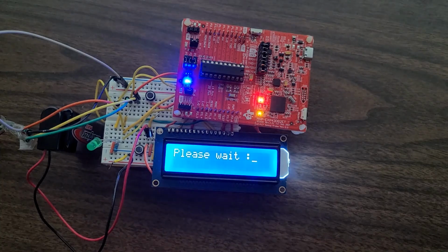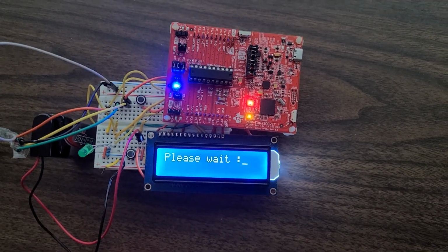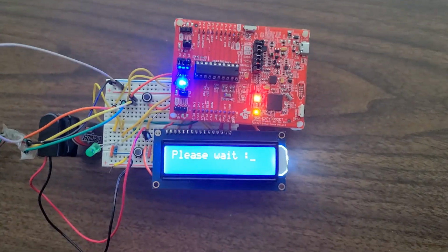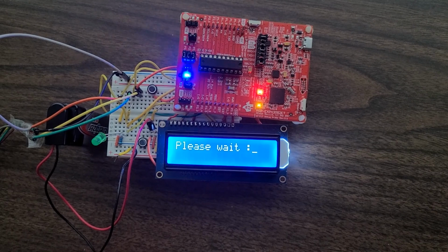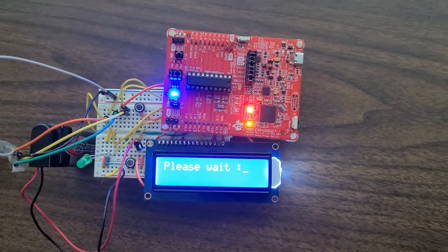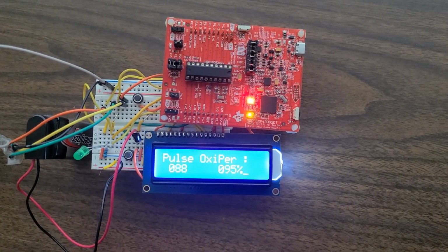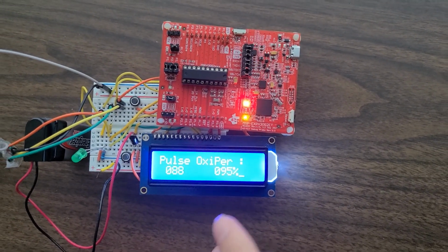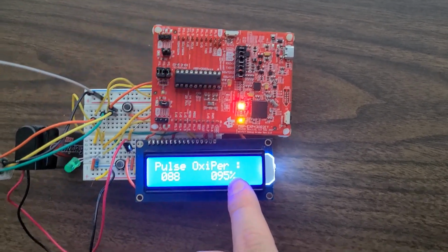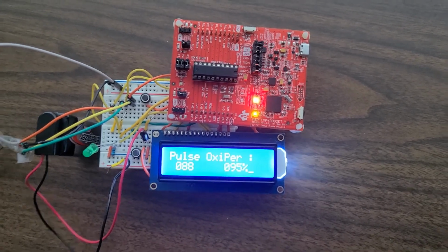So it's now measuring your heartbeat, and we can also look at the progress using this green LED. It changes every time it records a heartbeat. So now at this point it's actually measuring the oxygen saturation level. Now as we can see, we have a pulse rate of 88 and oxygen saturation of 95%, and these are the expected values that we expect from a normal human being. Alright, thank you.